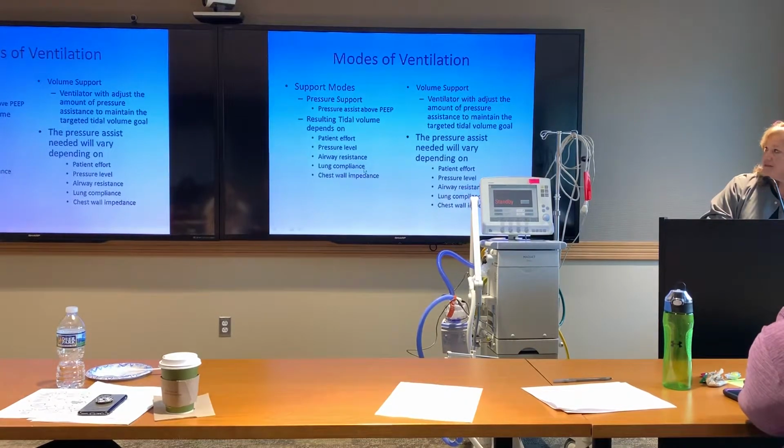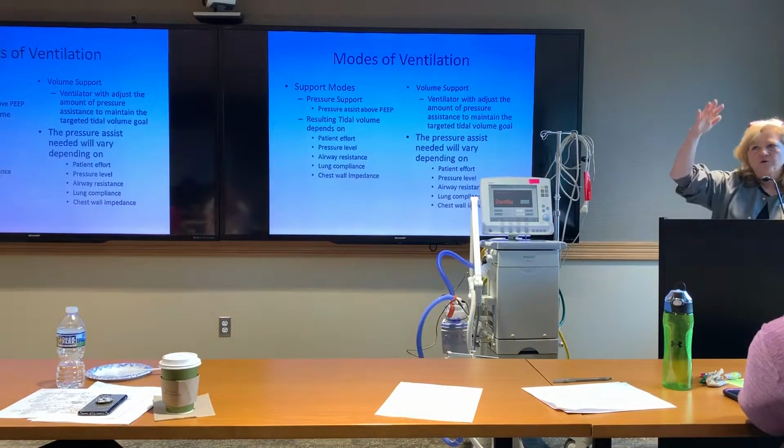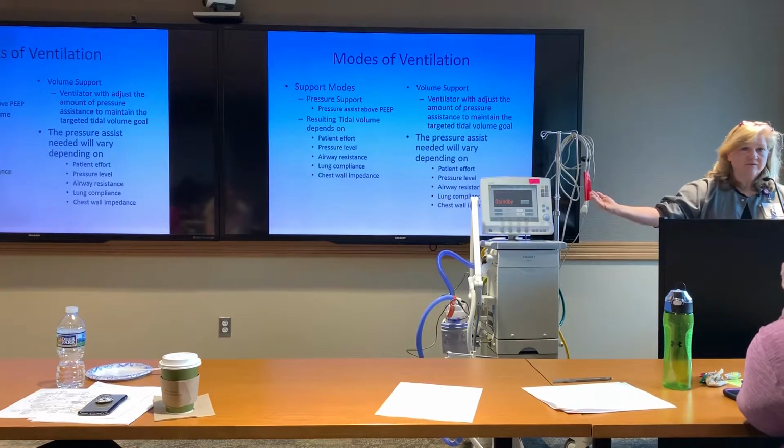Another option to pressure support is called volume support. Volume support is like pressure support, only I have a tidal volume goal. I want to keep my tidal volume around 300. So the pressure support will go up or down to keep my tidal volume where I want it. So it's not a weaning mode. I can't assess somebody for readiness to wean using volume support because it's going to maintain my tidal volumes.